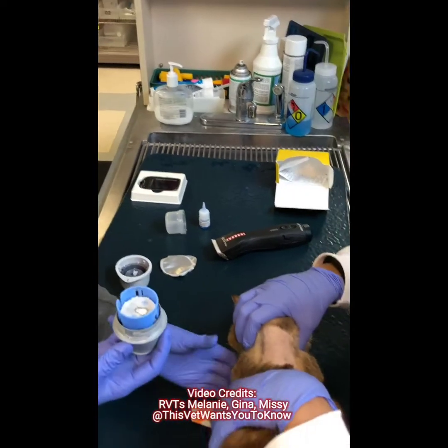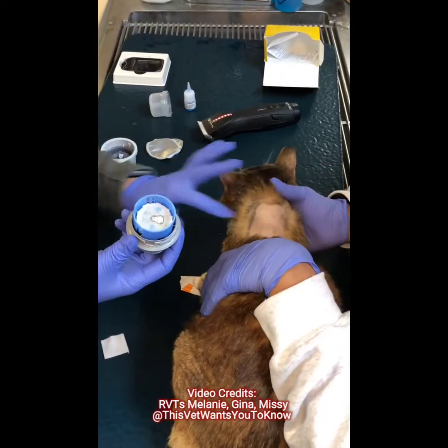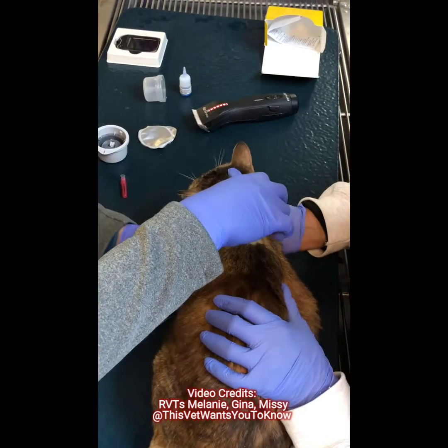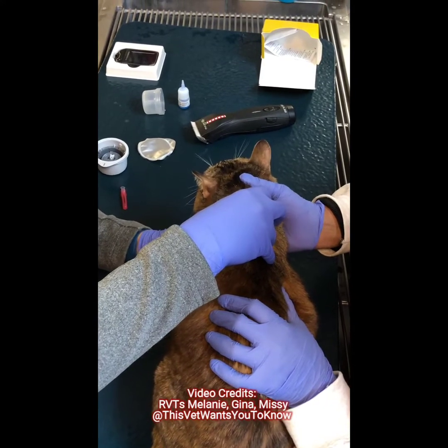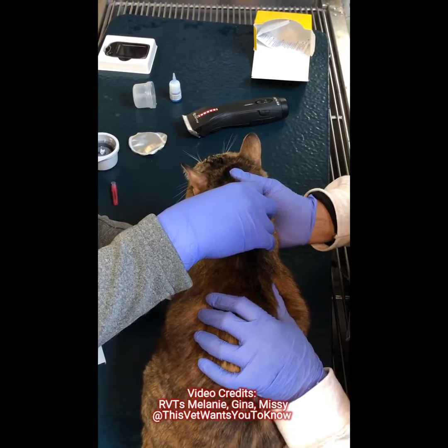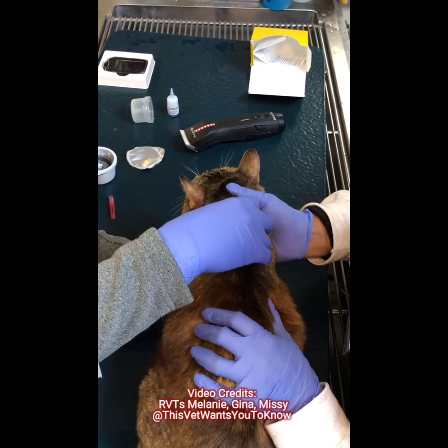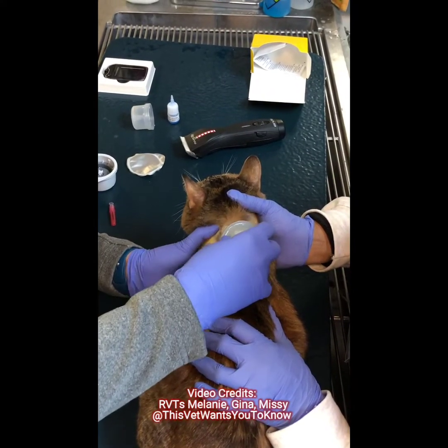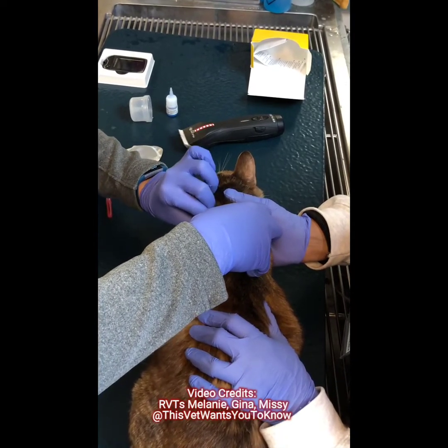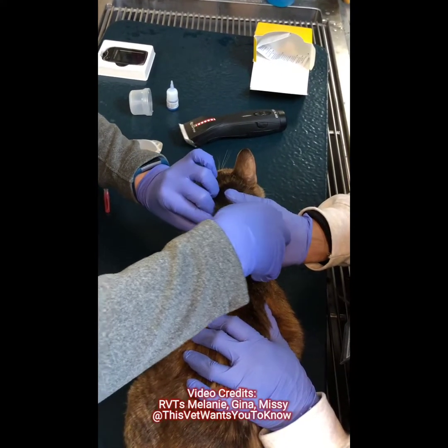Then all we do is turn it over and click it in place. They usually don't react very much at all to this. One, two, three — good job. I'll just hold it there for a second to allow the glue to dry and adhere to the skin, and then you just pull it. Sometimes you have to grip the sensor and peel it off.